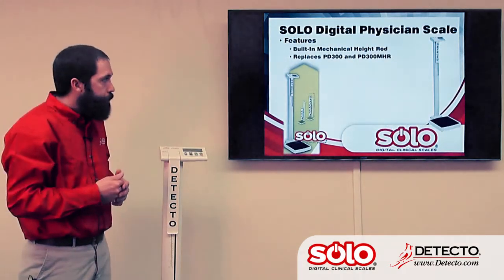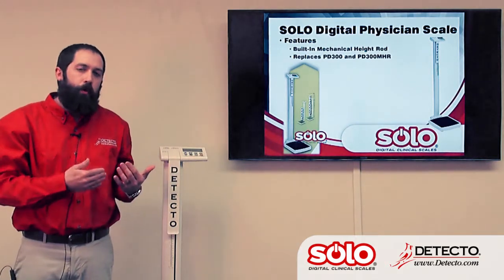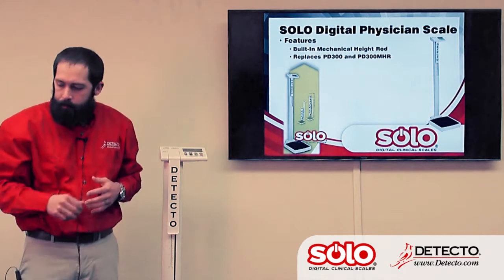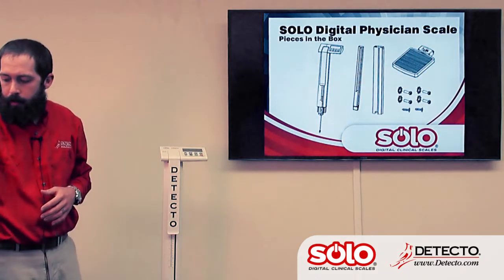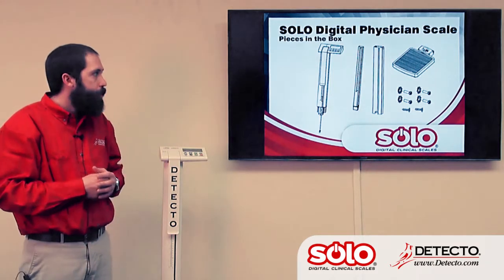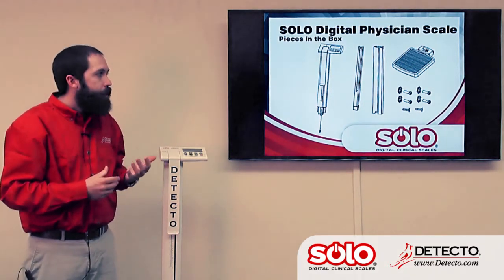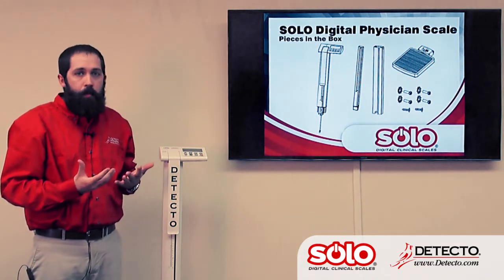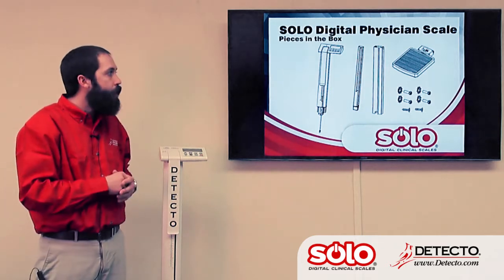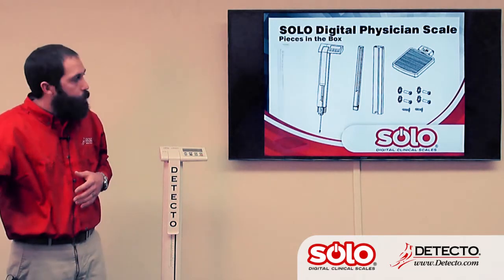Now we're going to move to the Solo scales. The Solos have a built-in mechanical height rod, which is what you see here. These models replace the PD300 and the PD300MHR — the previous ProDoc stand-up position scales. As far as assembling the Solo scales, it's fairly simple. In the box you get the top piece with the display and the top half of the column and height rod, the bottom half of each, and then the platform plus the screws and mounting hardware. To assemble, you take the bottom part of the height rod and attach it to the top part, do the same with the column bottom to the top, and then that whole assembly fits into the base of the scale. A few screws hold it all together, and it's ready to weigh as one assembled unit.